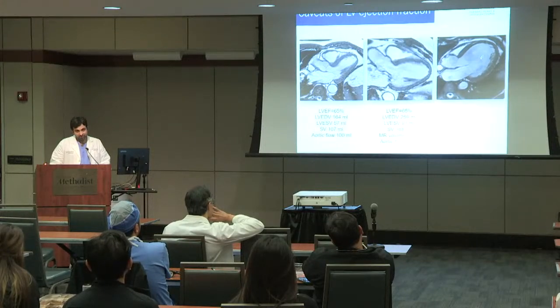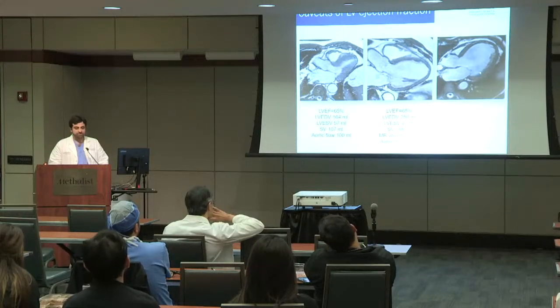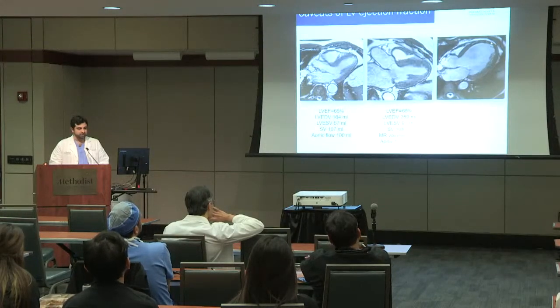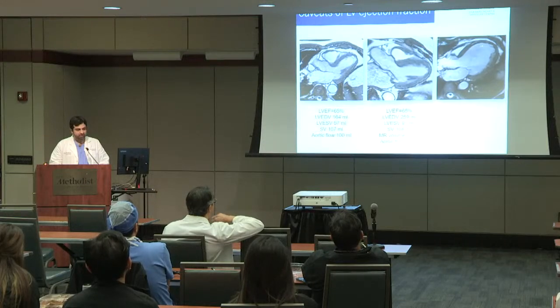Well, we don't see the inferior wall here. So this is inferolateral, but there's hypokinesis also. Yes, it's not as bad as here. There's also probably fatty metaplasia. Wouldn't you agree also? You see that darkness here.